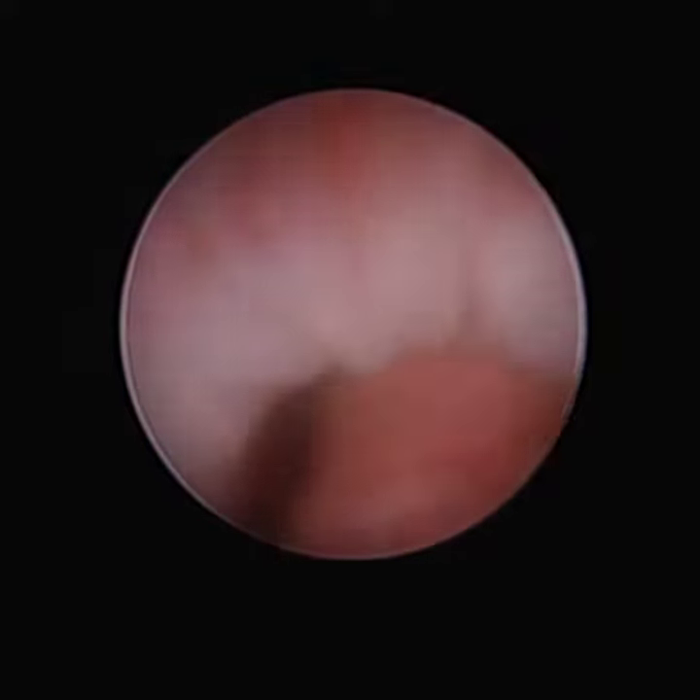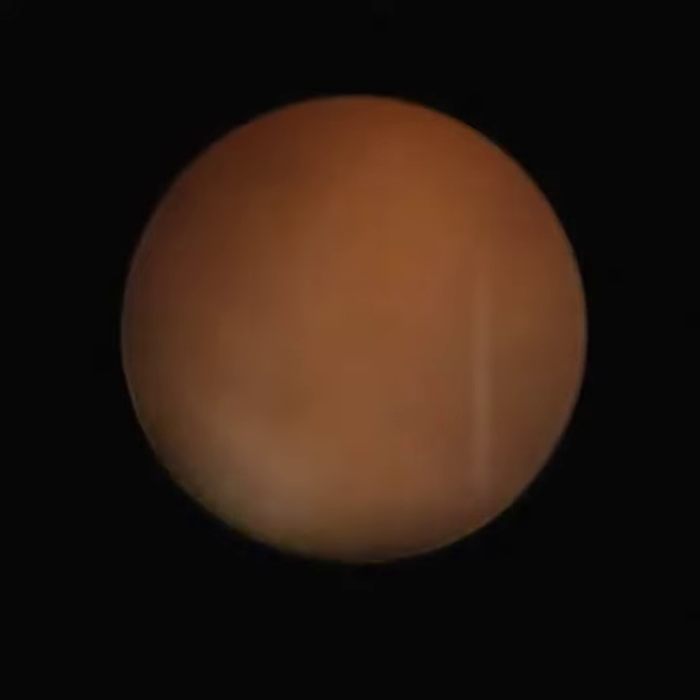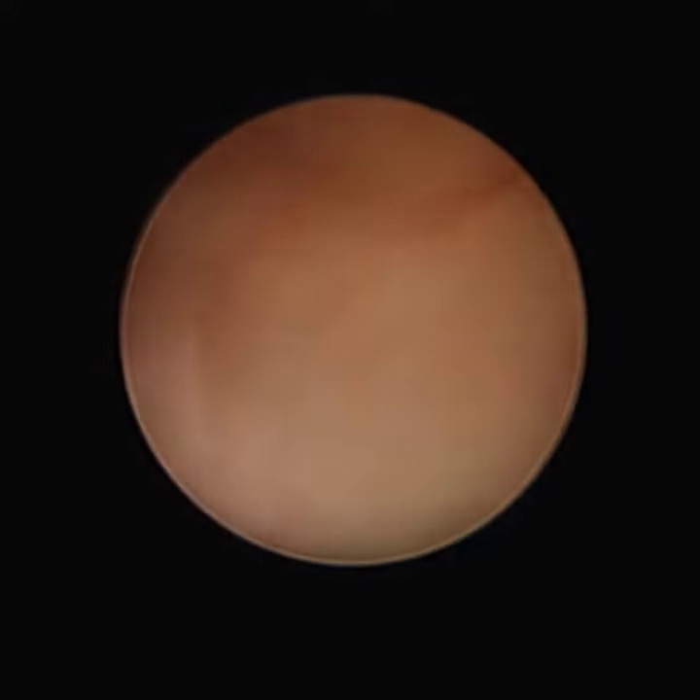Now we can see the veru. Now we can see the bladder neck, and proceeding to the bladder neck.